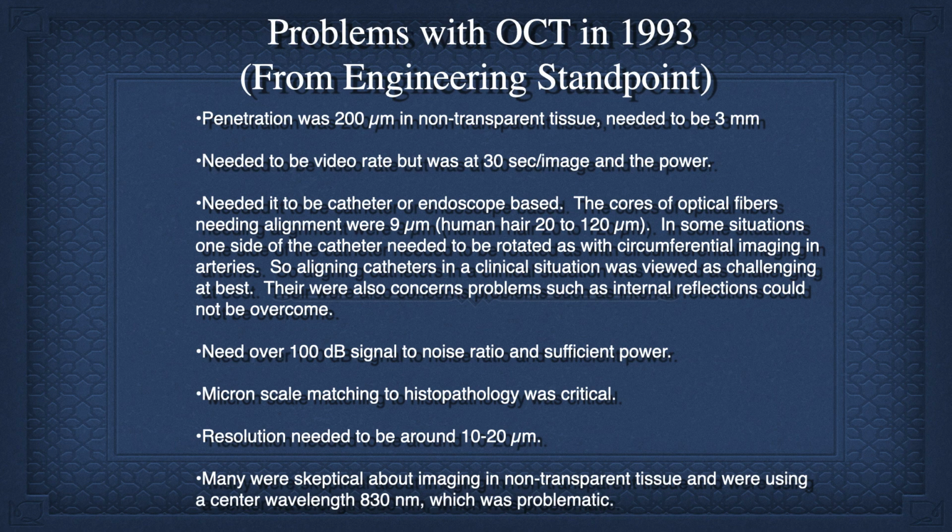That's an important engineering question and needed to be addressed. Increasing the dynamic range, which is critical for penetration and contrast. I put in micron scale matching of histopathology, which I don't know if you call that engineering or not. It does actually. We had to engineer the way we were doing it, and we need resolutions about 10 to 20 microns.